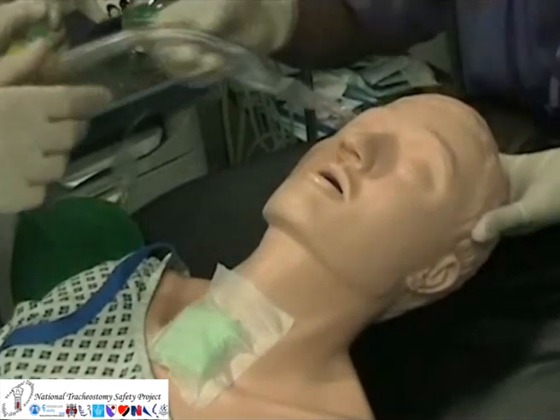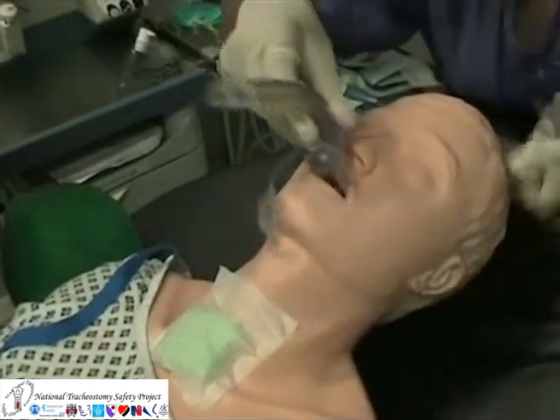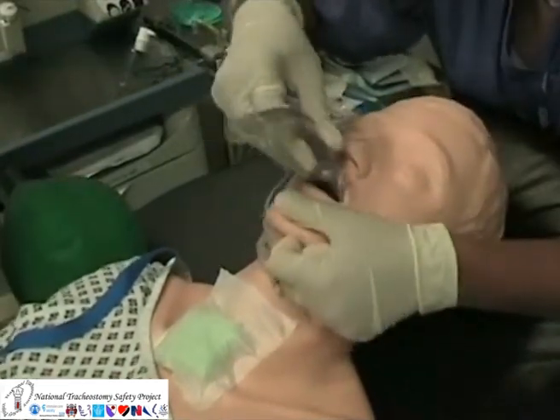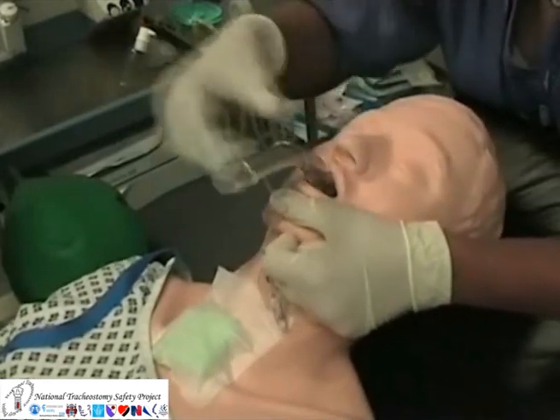A supraglottic airway device such as a laryngeal mask airway can also be inserted as shown here.